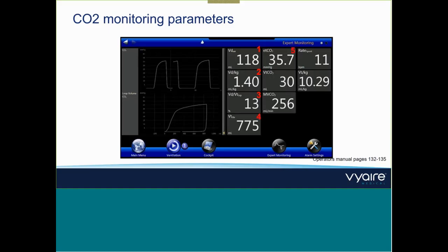And then, referring to the webinar today, that's the ETCO2. ETCO2 on Bellavista is available in 4 different standards: millimeters of mercury, hectopascal, kilopascal, and percent. But I think in most parts of the world, millimeters of mercury is still used. Then we have the CO2 elimination per breath, which is the VTCO2. Then we have the CO2 elimination per minute.